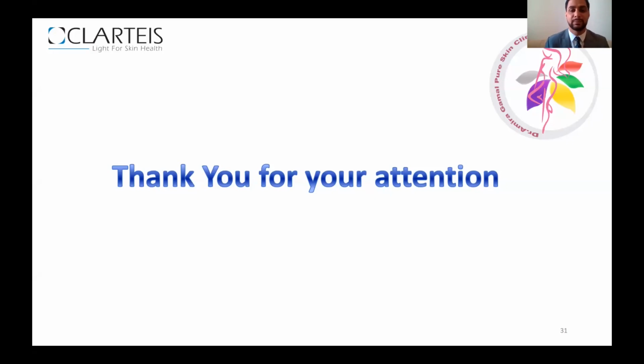Okay. I think that all the participants would like to know what are the precautions we need to take after an Excimer session or after Exciplex treatment? Actually, the precaution is very minimal. I told my patient in the first session not to have direct sun exposure directly after the session, as any session we are doing. Don't rub your skin. Don't put a cleanser or detergent on the skin. The usual precautions for our treatment, but there are no very hard precautions with Excimer light because it's very simple.